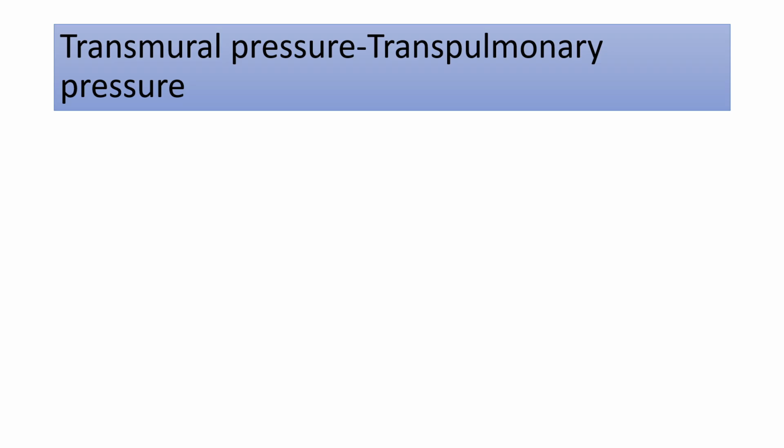Before ending, we should know one terminology: transpulmonary pressure. Transpulmonary pressure is another important factor which helps us in understanding ventilator mechanics and reducing ventilator induced lung injury. Most of the new ventilators like Hamilton have the ability, in the advanced setting, to monitor transpulmonary pressure and set your positive end expiratory pressure according to it. Transpulmonary pressure can be measured by an esophageal balloon, with the esophageal probe kept in the esophagus, which is a surrogate. So first let's understand what transpulmonary pressure is.